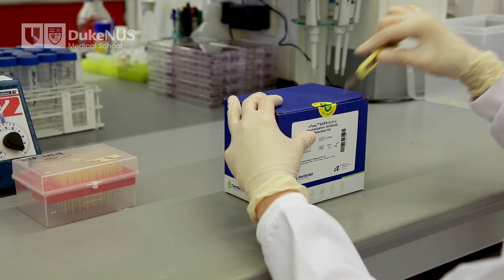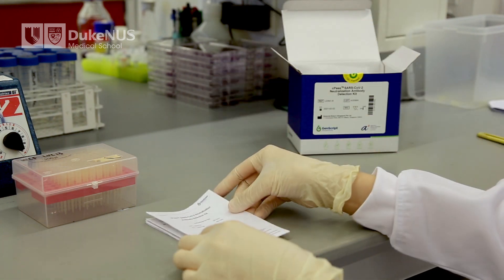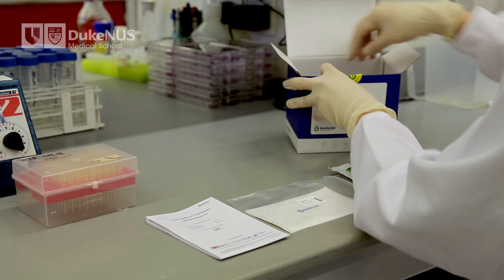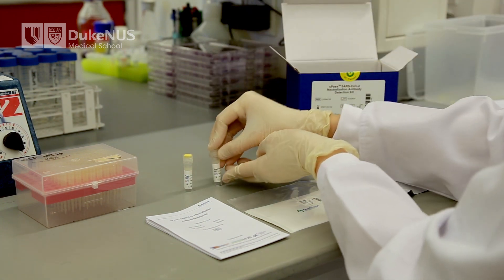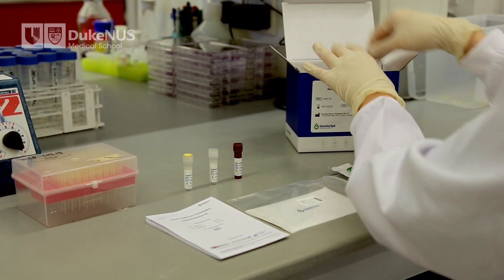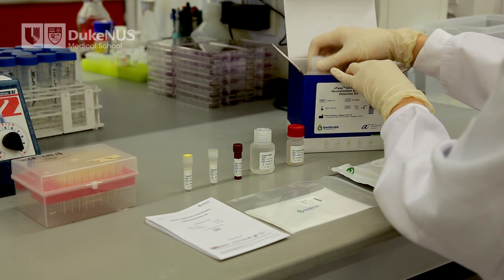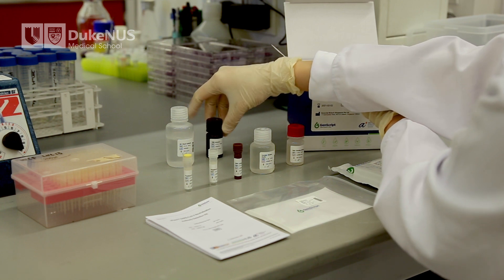Inside the box, you will find the following items: a user manual, two pieces of plate sealer, a capture plate, a positive control tube, a negative control tube, the HRP-conjugated RBD, sample dilution buffer, dilution buffer, dilution buffer for the HRP, 20 times concentrated wash solution, the TMB solution (which should be protected from light), and stop solution.